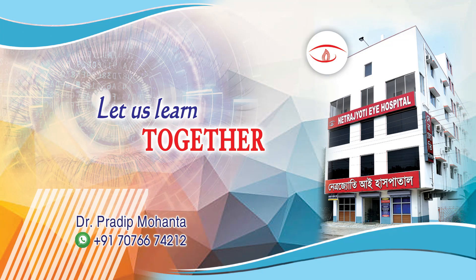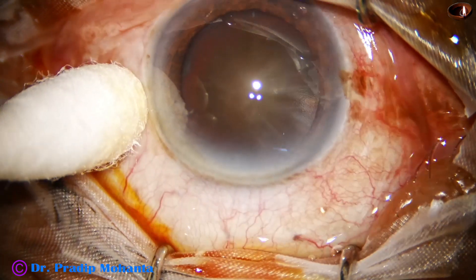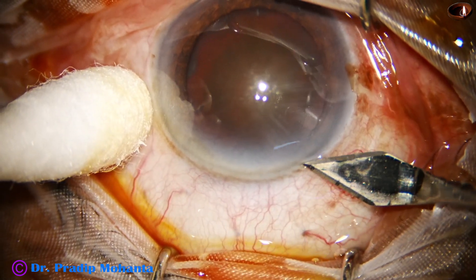Friends, welcome to my workplace at Ranakh Heart, West Bengal, India. Let us watch management of this rock-hard cataract.